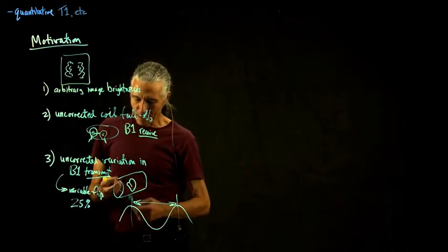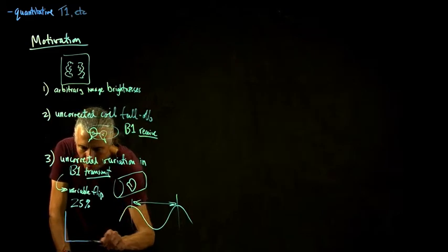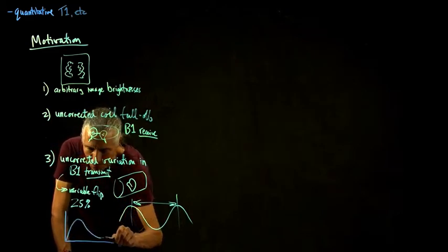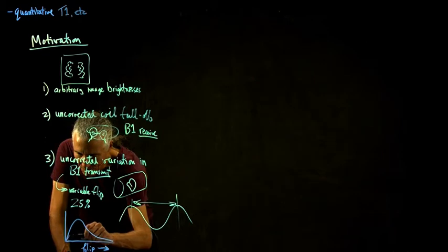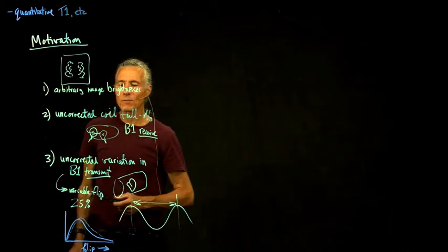Now, that doesn't seem like that much of a problem, but if you remember back to our first assignment, when you plotted out the signal as a function of flip, what we're trying to do with these scans is distinguish two tissues, say, one was white matter and one was gray matter.